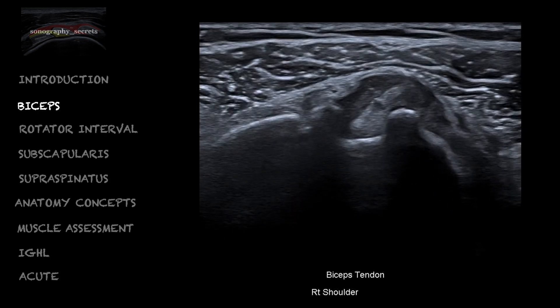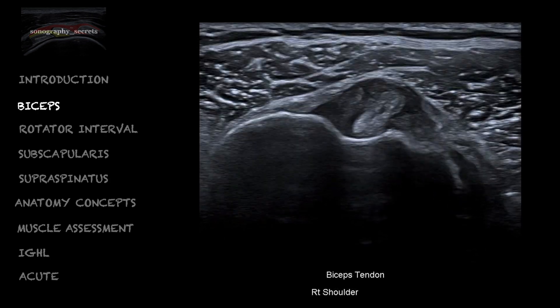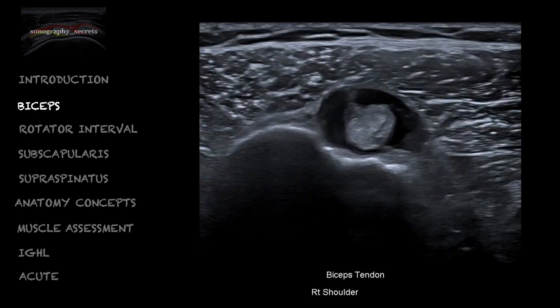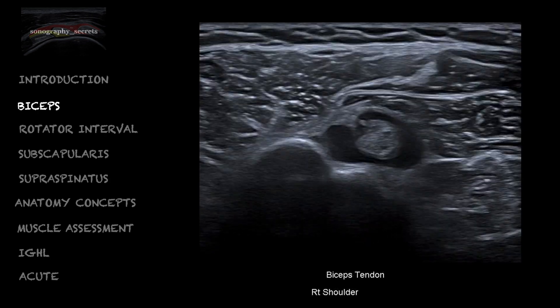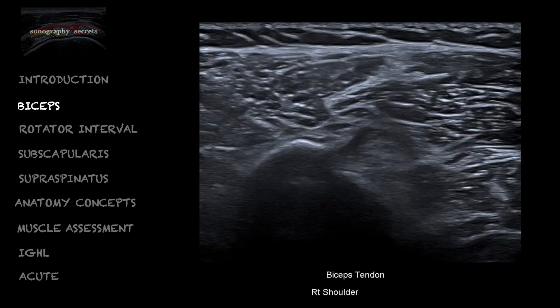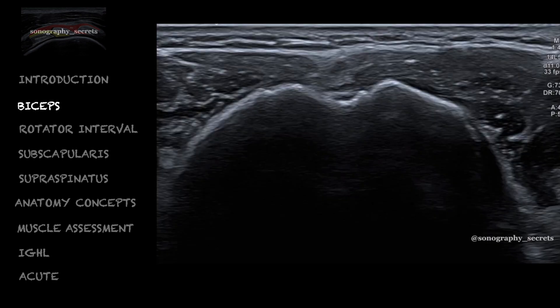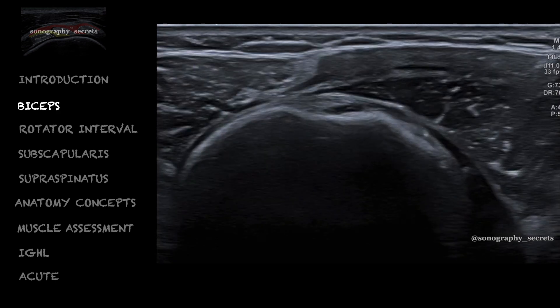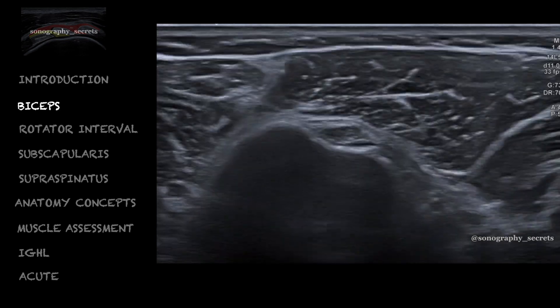This long head biceps tenosynovitis can be a significant pain driver for the shoulder. In cases where we are unsure as to whether or not the biceps tendon is present — most likely it isn't — we need to scan down the arm past the pec major insertion to the muscle bellies.